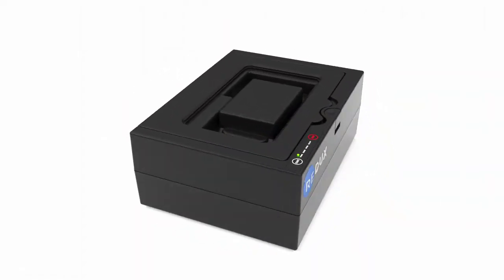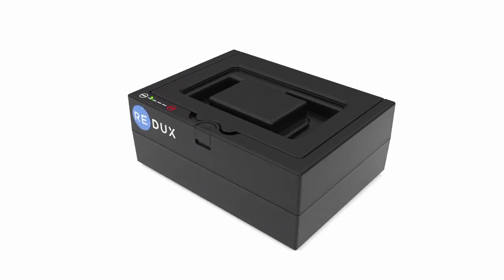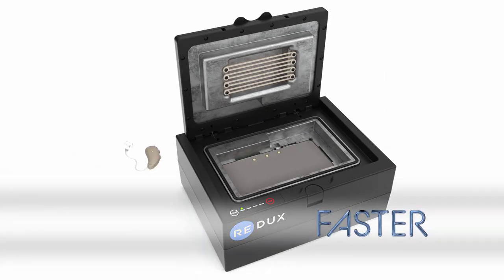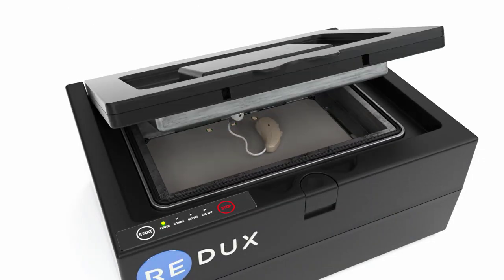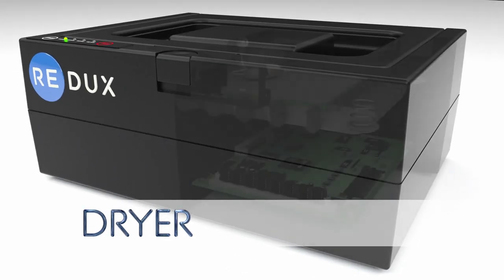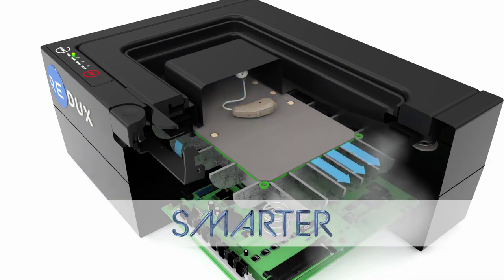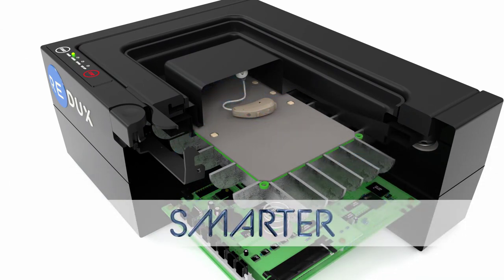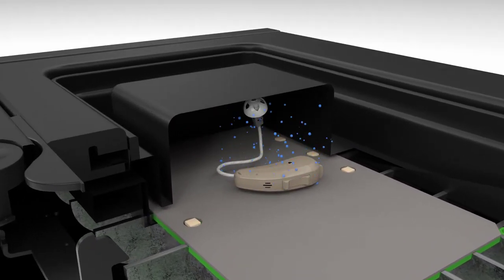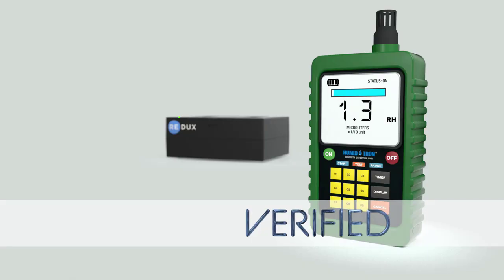Let me explain how all of this works. First, you initiate a drying session on a computer that is wirelessly connected to the Redux. Then you place a hearing aid into the drying chamber. When you start the drying process, the Redux pulls air out of the drying chamber, creating a vacuum, which actually reduces the boiling point of water from 212 degrees Fahrenheit to 98 degrees Fahrenheit. It safely heats up the chamber to cause evaporation, and then replaces the air in the chamber with fresh dry air, measuring the humidity levels in the extracted air to determine when drying is complete.